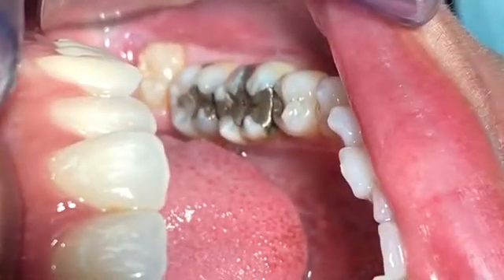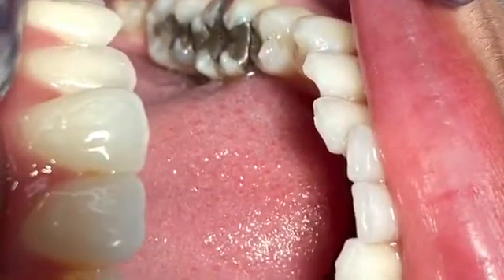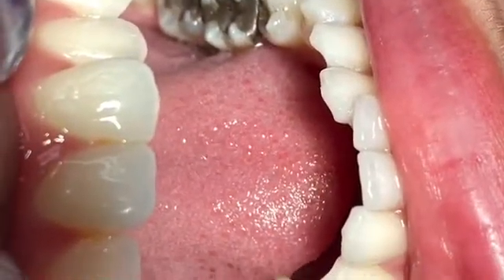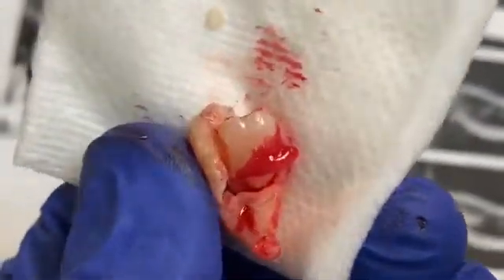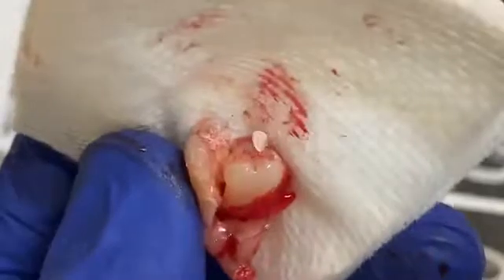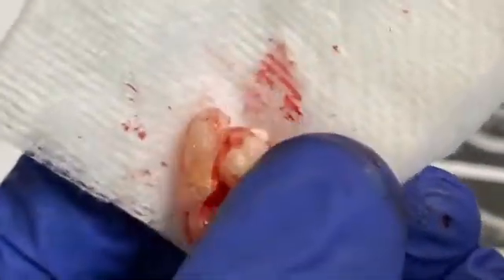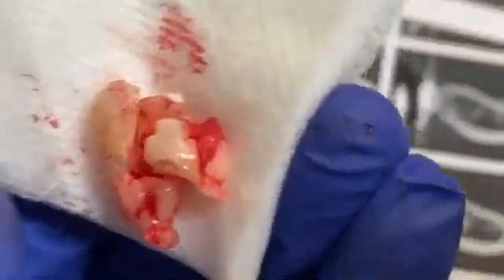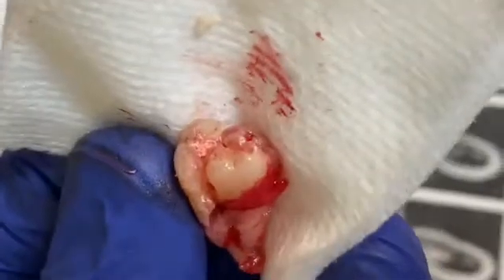Every case can be slightly different. You have to make sure you've learned a few techniques about flap design. In this case, after I removed it, I sutured with primary closure completely. The patient was happy to go home. We gave her antibiotics and pain medication just as a precaution for infection and pain, and she's going to come back in a couple of weeks to have the suture removed.